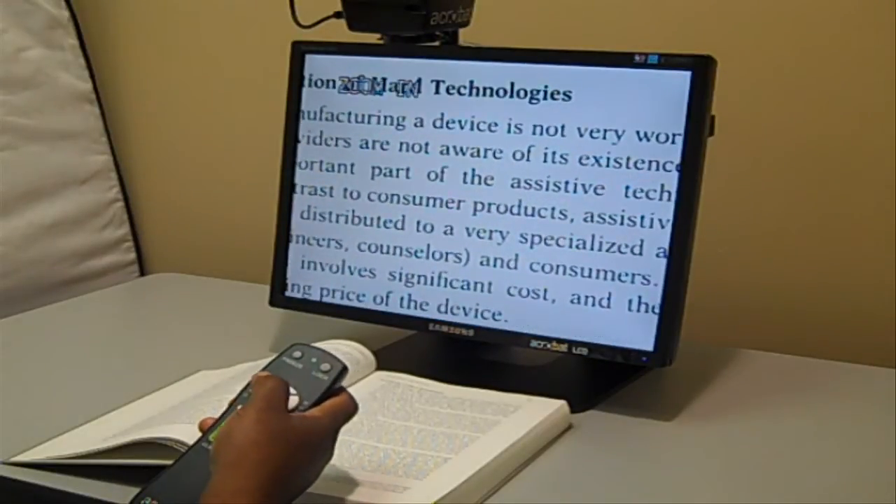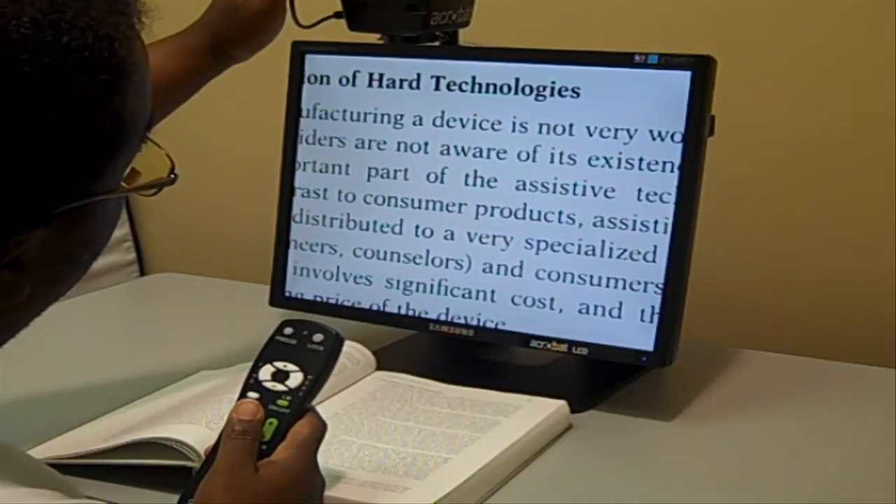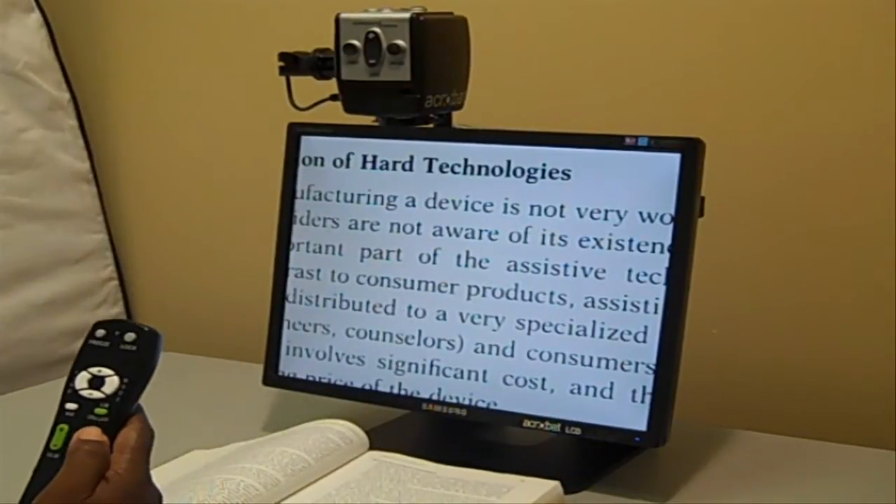In my case, I need a little bit more magnification, and that's good for me. These features are also located up on top where the lens controls are.